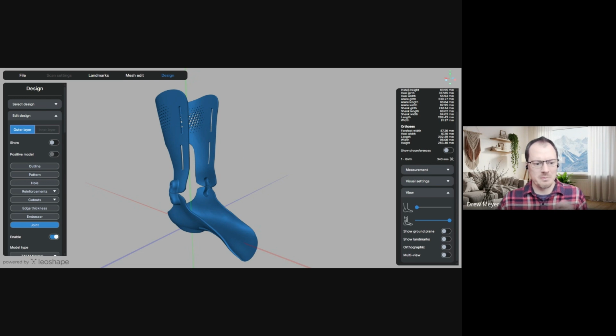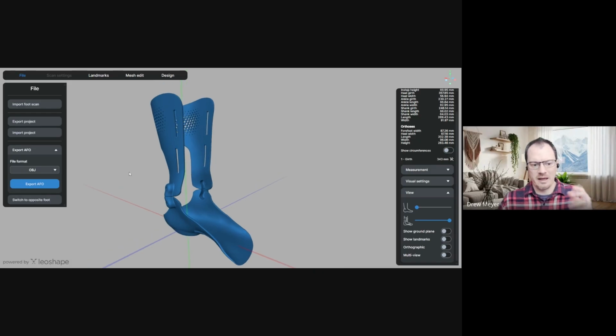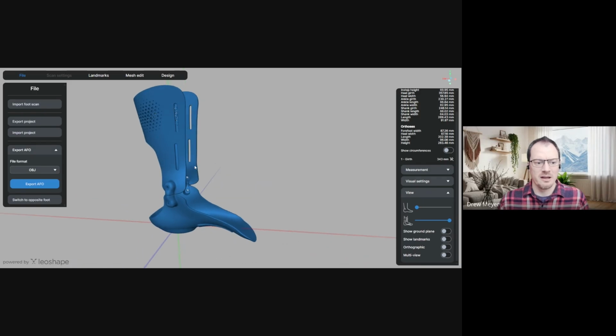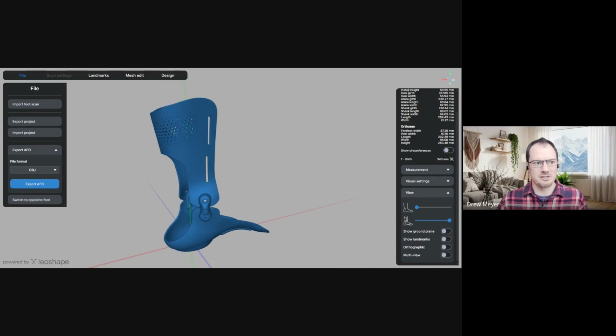I think it's called Form Now, and you could basically export this file. You could pick an STL or an OBJ file, export it out, drag and drop it, and have it in like 4 or 5 days for, you know, 60 or 80 bucks or something like that. So that's a really interesting workflow that's just recently been made available from the Formlabs team.